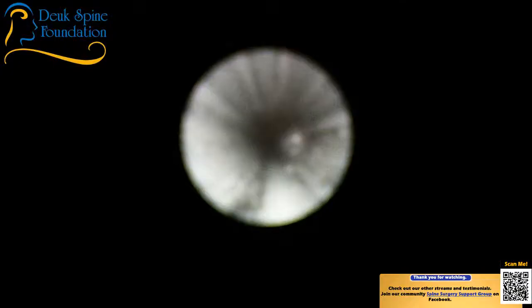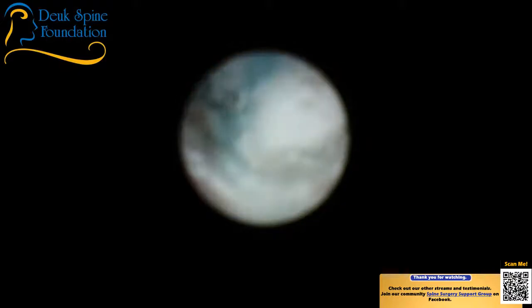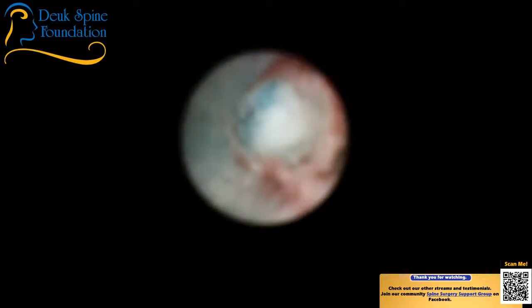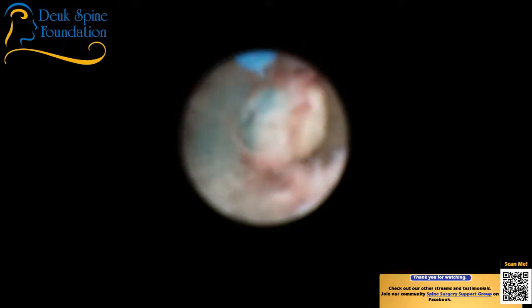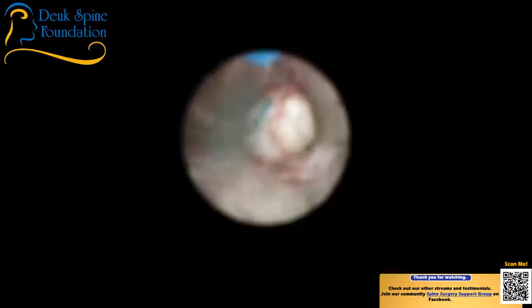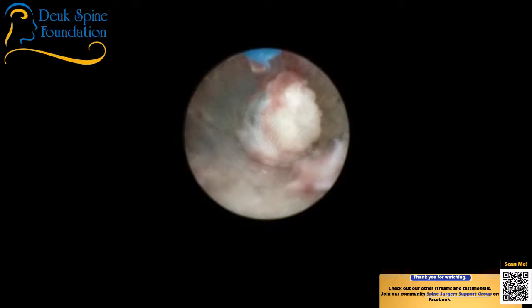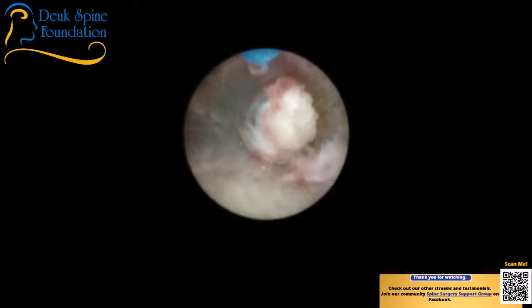So some of the unique challenges because of this patient's body habitus are that she has a large chest. Anybody with a large chest is going to basically push the endoscope away from the neck, from the spine, which makes it a lot harder to do the surgery. All right, I'm going to try to grab that piece of herniation out.